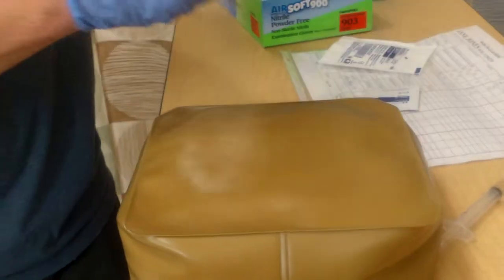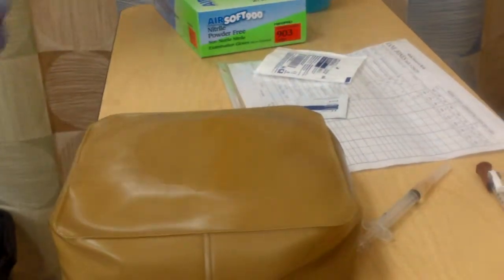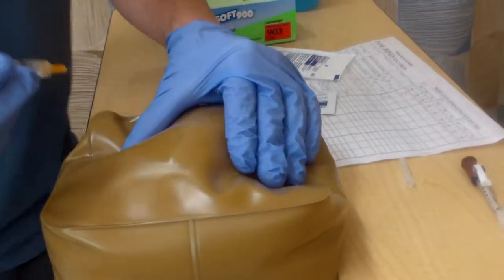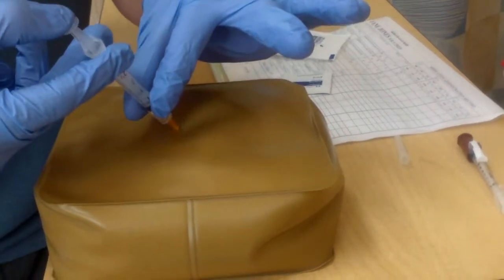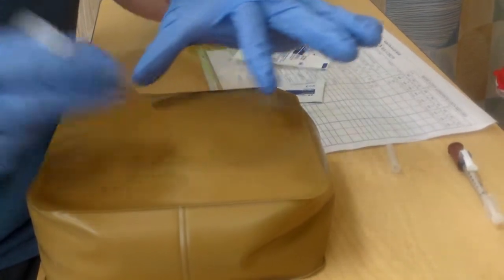I would need to clean it with an alcohol prep. Starting from the center, work my way outward, clean that up. And then for this one, I need to give it a little squeeze there so I can make sure I get into the subcutaneous. And then a 45 to 90 degree angle, I'm going to use a dart-like motion, put it in, release, stabilize, and then slowly inject my medication in there, 1 ml per 10 seconds, then release.